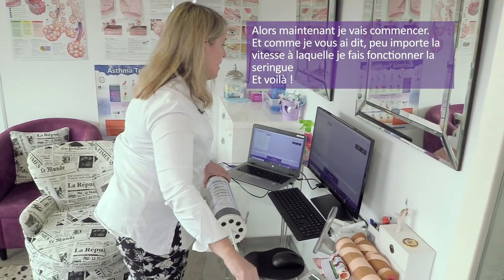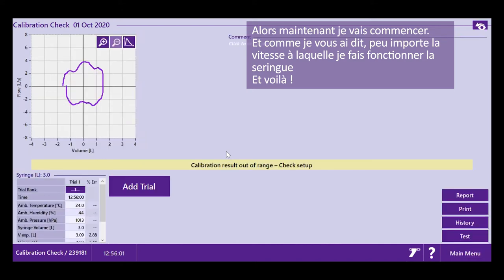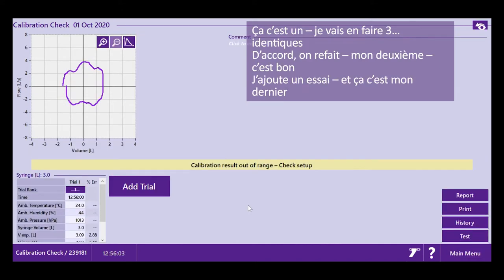To start with, I have to block the outlet so that the baseline setting is correct and doesn't pick up any air movement in the room. Now I'm going to start. It doesn't matter how fast or slow I actually move the syringe. There we go — that's one.